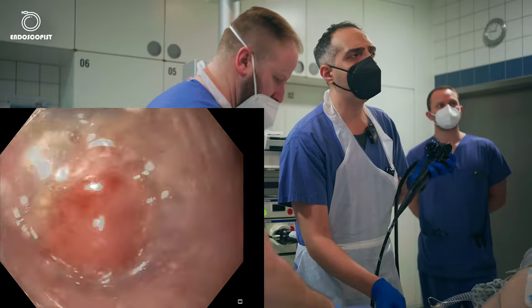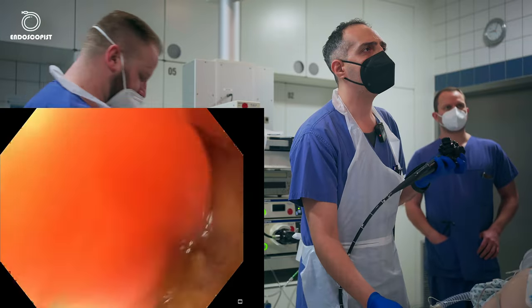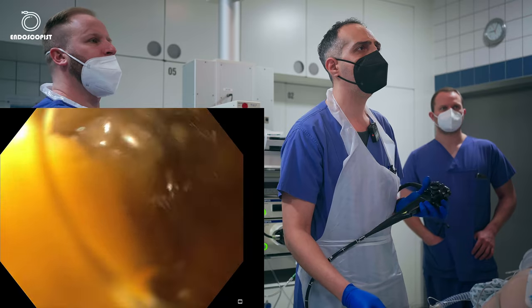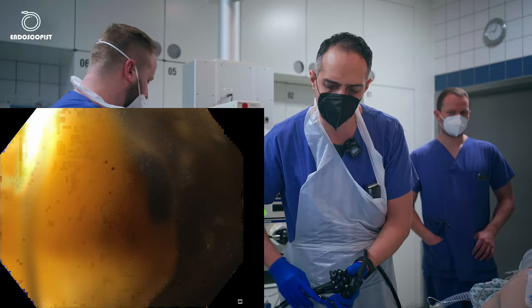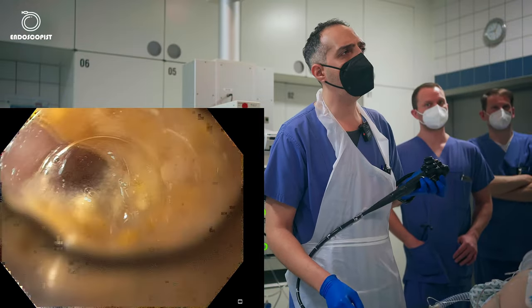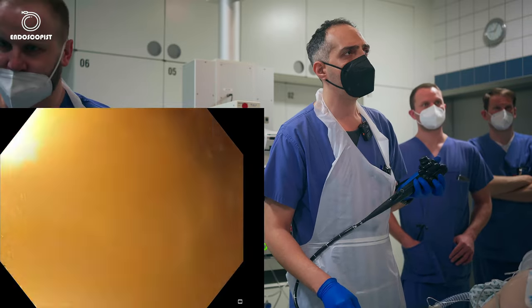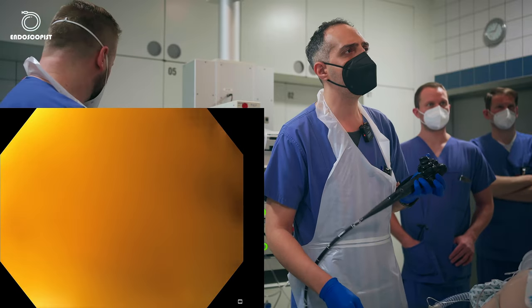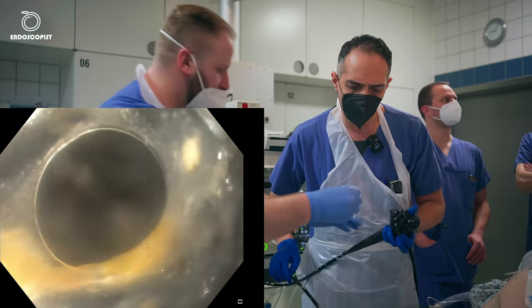So we usually keep the patients on a liquid diet a couple of days before the examination. But as you can see here, there's still some food remnants inside the esophagus. That shows us how achalasia can be very dangerous if you do it in a routine examination, because it often happens that the patient will aspirate during the examination. So you have to be cautious when you're doing diagnostic upper endoscopy for patients with achalasia.